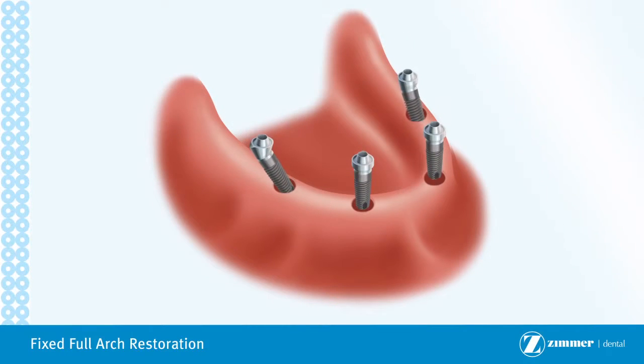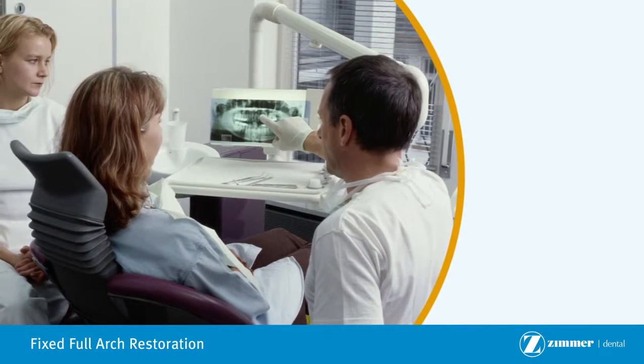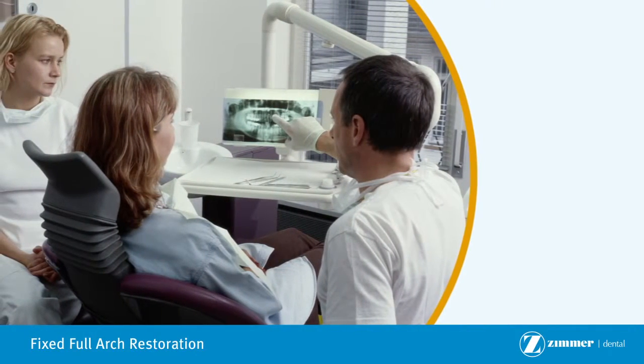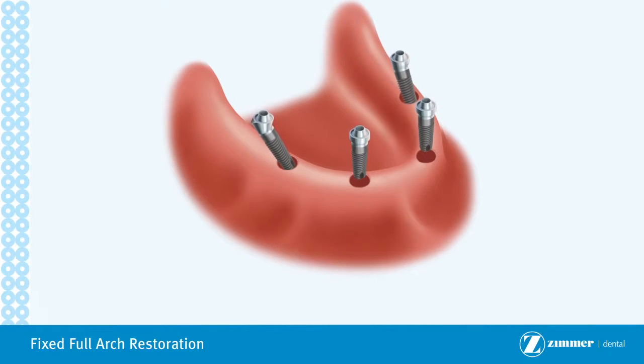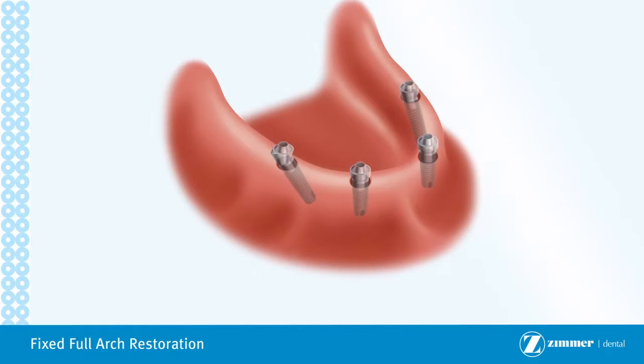In this procedure, multiple implants are placed. Based on your situation, your doctor will determine how many implants are appropriate for your case. The implants are typically left to heal for a few months. However, a temporary restoration may be delivered at the time, or within two weeks, of when your implants are placed. Exact timing will depend on the quality of the bone where the implant is placed.